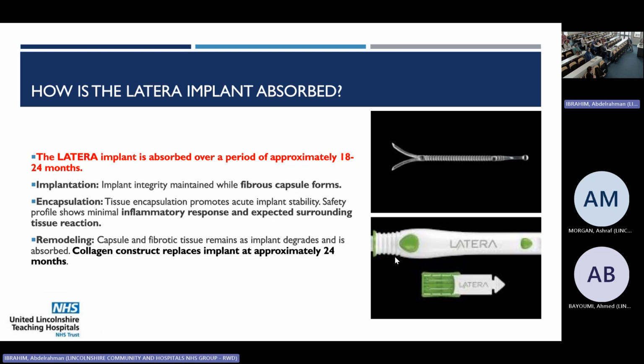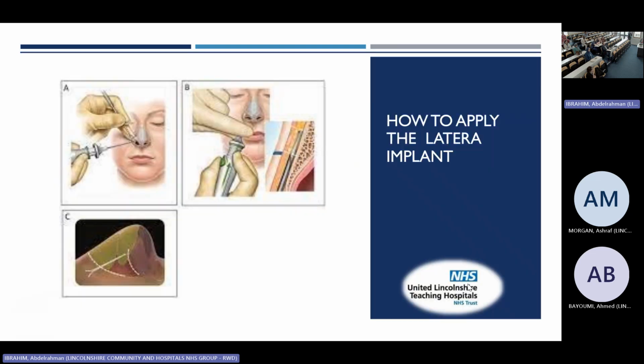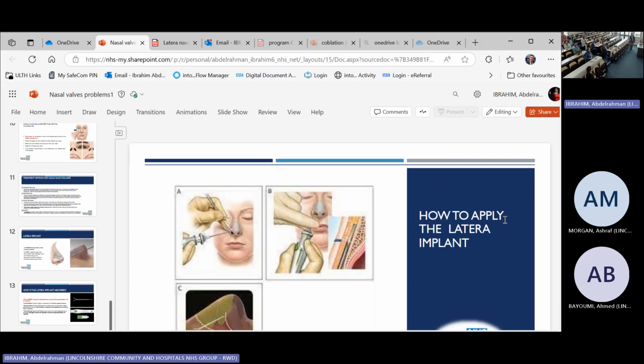We're going to have a look at how it works later on, hands-on, so I'm not going to go into the depths of it. And this is the package of the implants themselves. So we have a needle, like an introducer, and the implants. Okay, so I think this is the lecture itself.